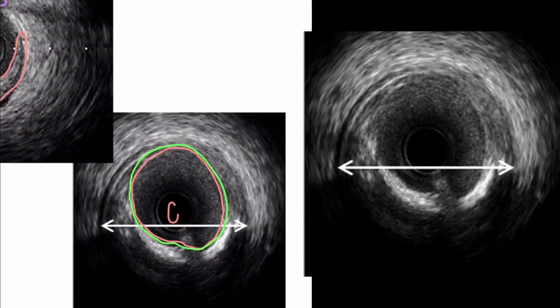Now can you see a black band? In some parts, yes, you can actually really only see it here and maybe a little bit there. Let me undo that so I can make sure. So you can definitely see this is a grayer and then this white here. So I know that's the intima. And then if I trace out this media with my finger, you can see there's a difference in texture between here and here.